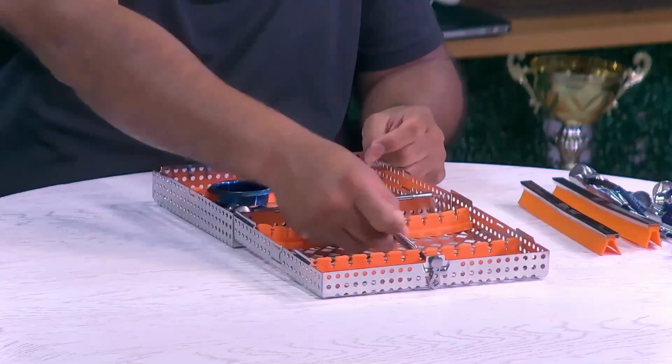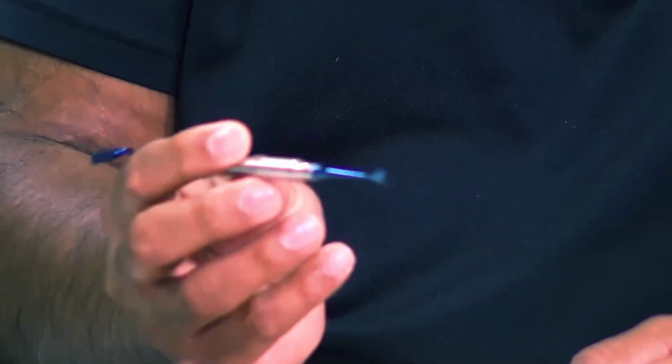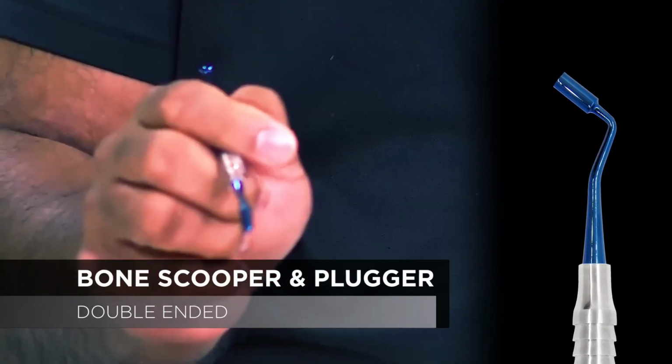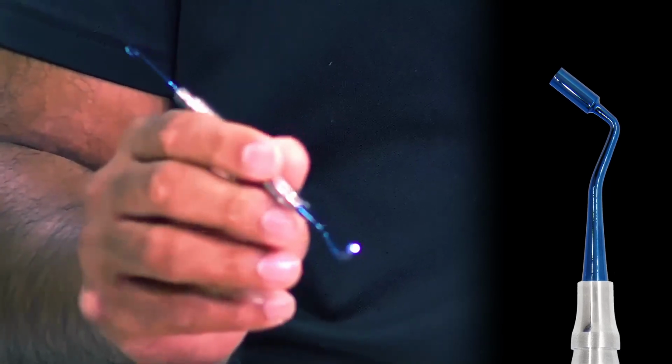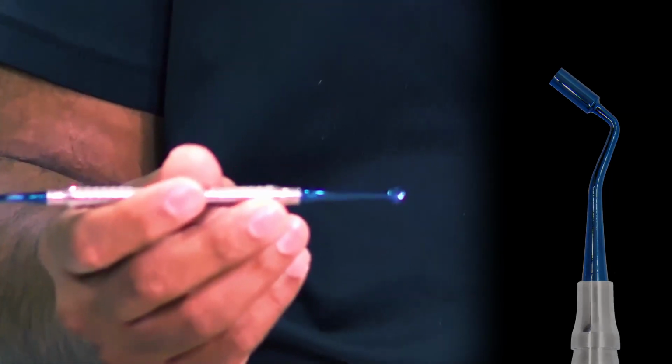As we continue to bone grafting, we have a bone scooper here. So a single instrument has on one end a bone scooper to grab your graft material, and on the other end a plugger to be able to compact it and plug it into the socket. Between this and my Explorer probe, we're able to do 95%, 98% of all our bone grafting procedures quite well. And I find that this also works really well with my PRF bone graft when we're holding it down so my assistant can suction any additional blood or juices that may be coming out of that bone grafting site.